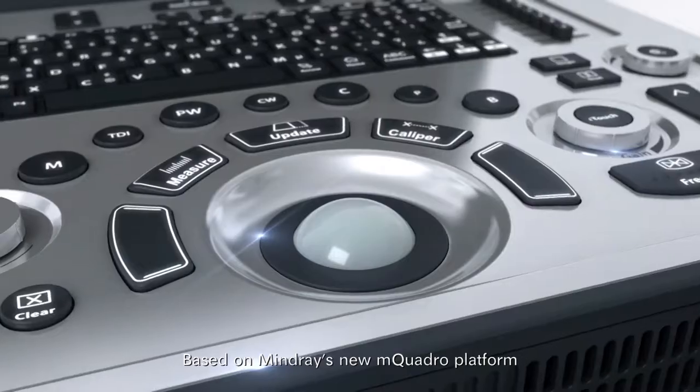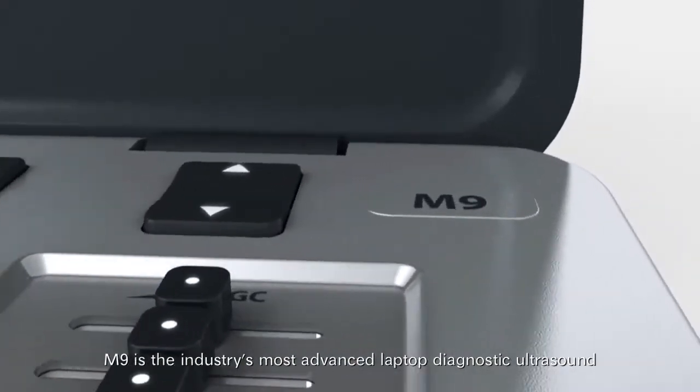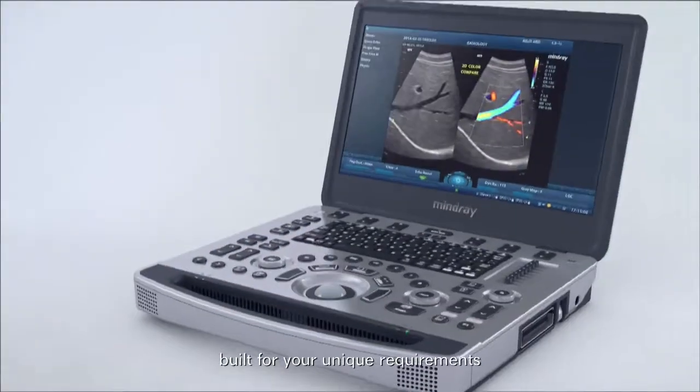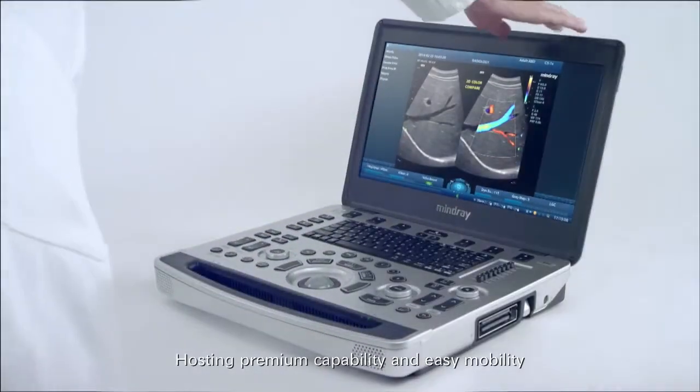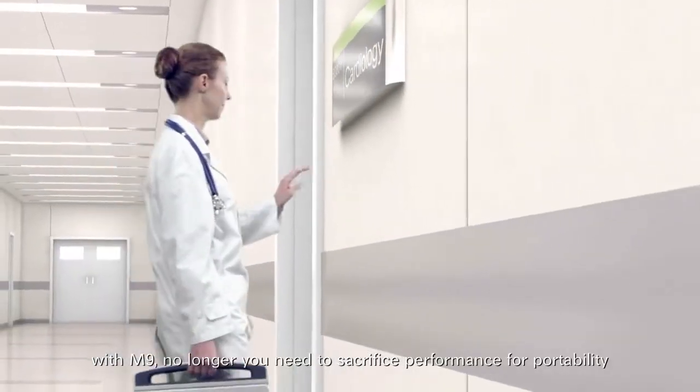Based on Mindray's new M-Quadro platform, M9 is the industry's most advanced laptop diagnostic ultrasound built for your unique requirements, hosting premium capability and easy mobility. With M9, no longer do you need to sacrifice performance for portability.